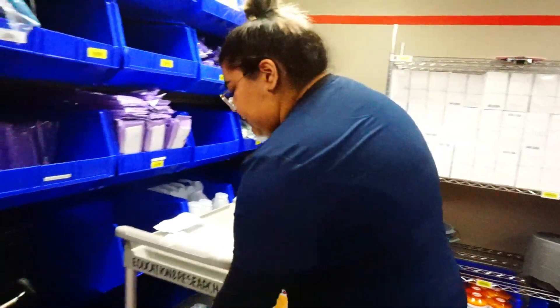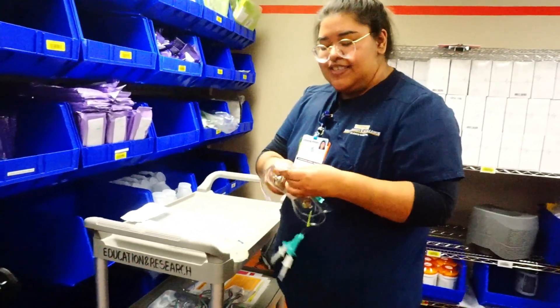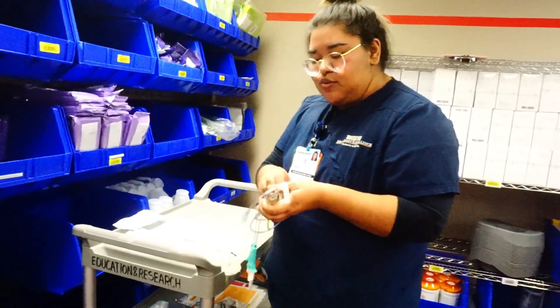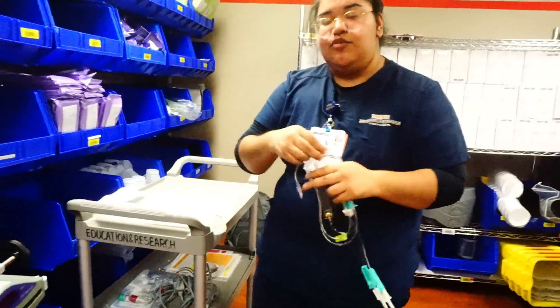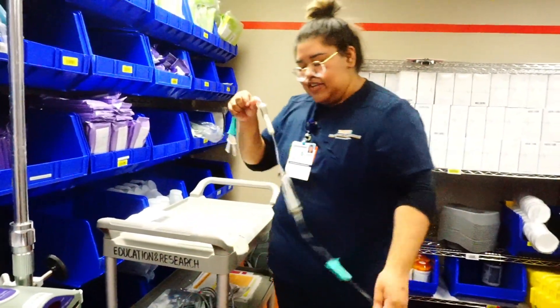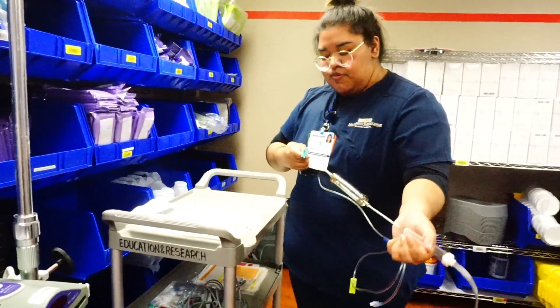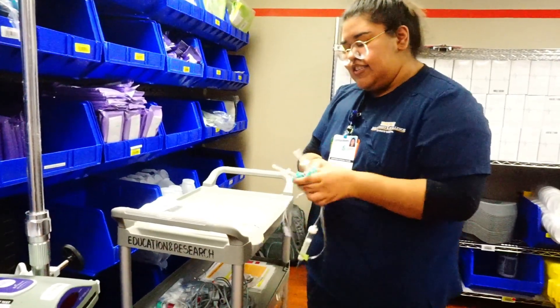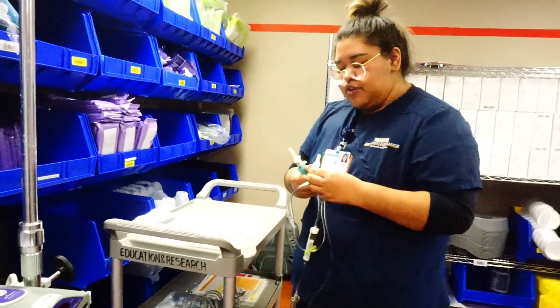We're going to take this and prime the entire tubing with saline. Remember, you should only be using saline as your fluid to run blood — especially not D5, because D5 will coagulate the blood. Then you get clots in your tubing, you can't give your product, and you're basically wasting blood that should be going to your patient.